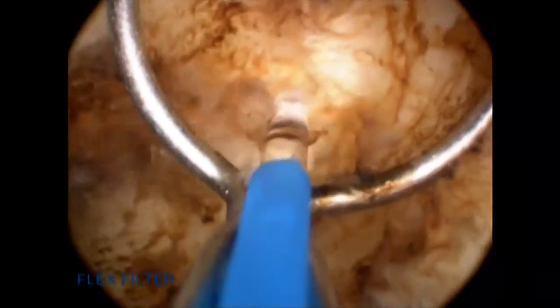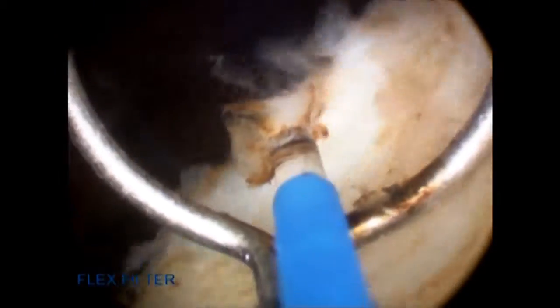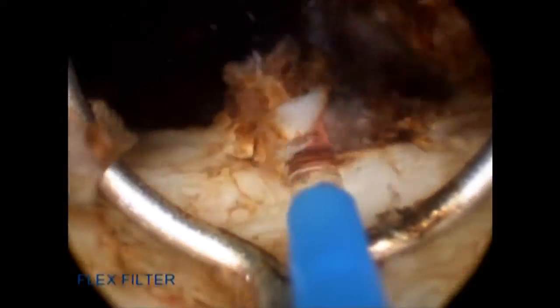If the median lobe is too large, I'm able to either split it in half down the middle with the end-firing fiber or cut it into different pieces before I enucleate. I'm then able to remove it from the bladder with either a basket or grasping forceps. If there is any bleeding at the bladder neck once the median lobe is enucleated, I'm able to use the end-firing fiber and coagulate that bleeding instantaneously — like a bovie on a stick. Once completely enucleated, I use grasping forceps to grab the floating median lobe and remove it from the patient.